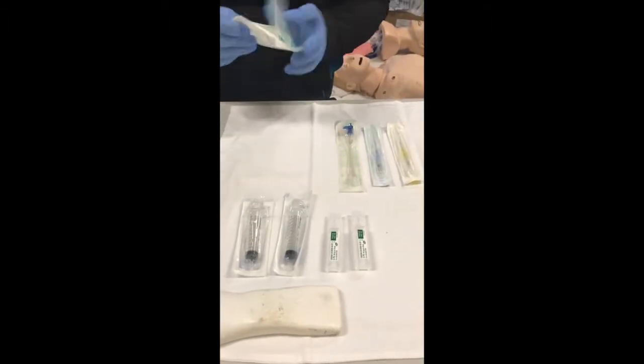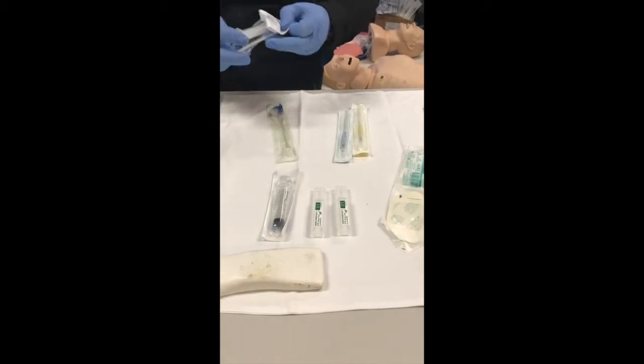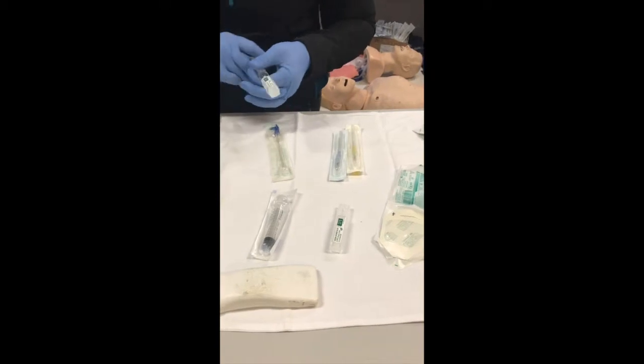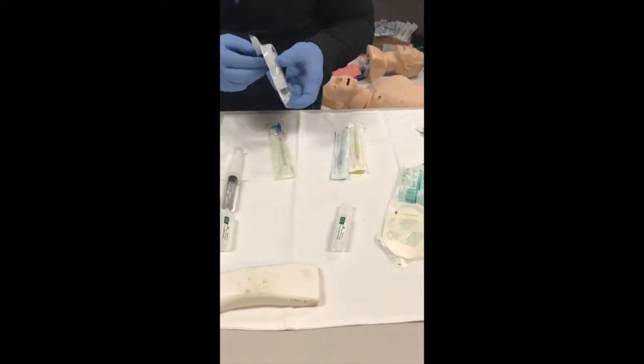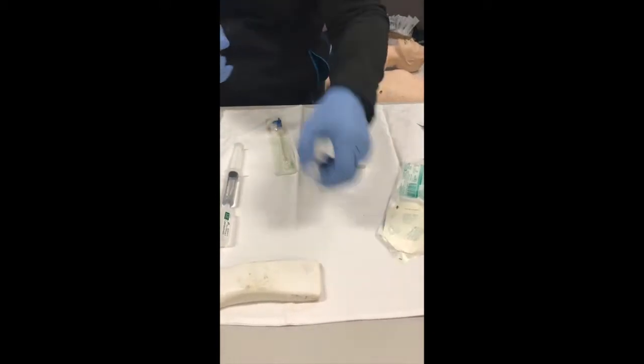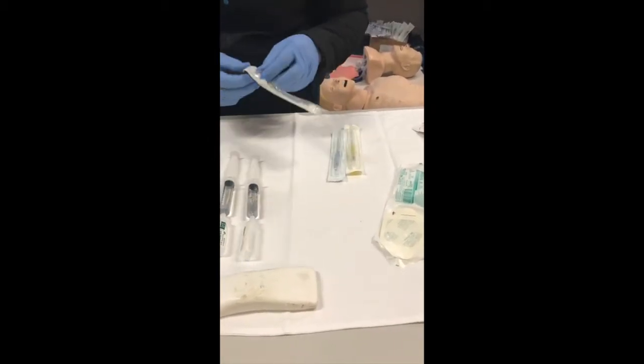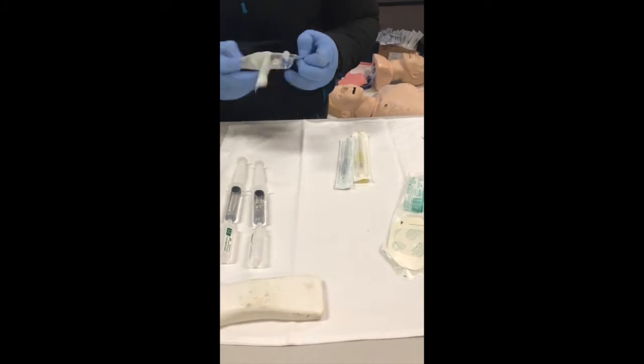Whilst waiting for the antiseptic to dry, I can prepare all my equipment further. I get my tegaderm out, I draw up two 10 ml normal saline flushes, and I prime my 3-way extension tap ready for when I need to attach to my cannula.